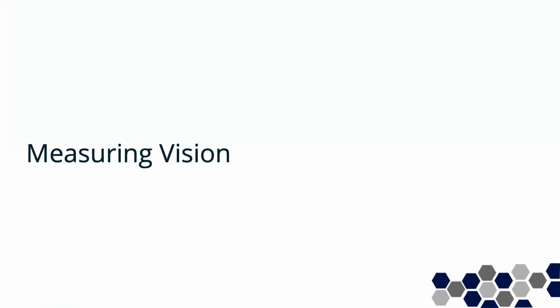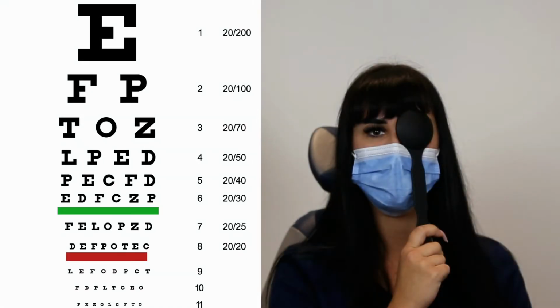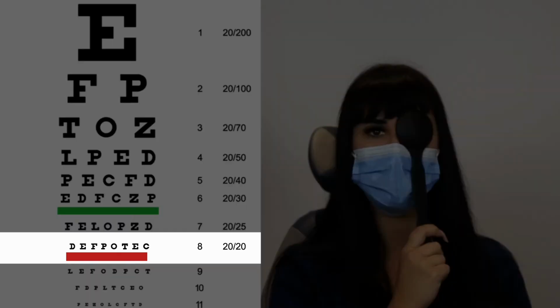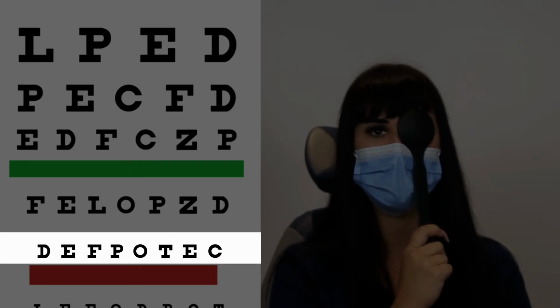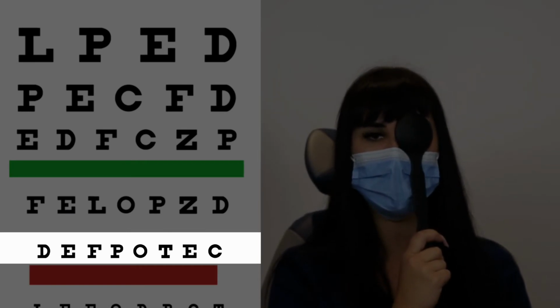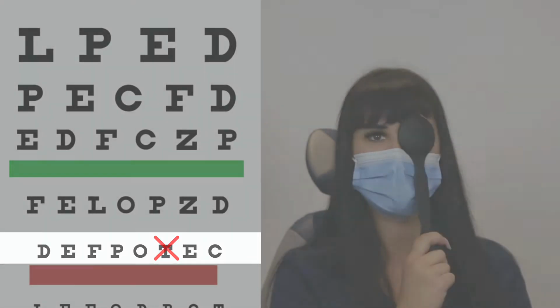Now let's go over some examples. First, let's start off with a case of normal vision. For the purpose of this video, we will skip to the 20/20 line. D, E, F, P, O, A, E, C. In this example, all of the letters on the 20/20 line were correct except one. Therefore, the vision is 20/20 minus 1 in the right eye.